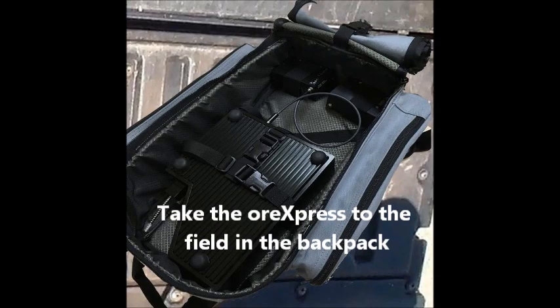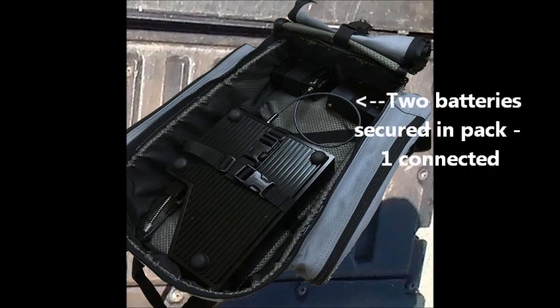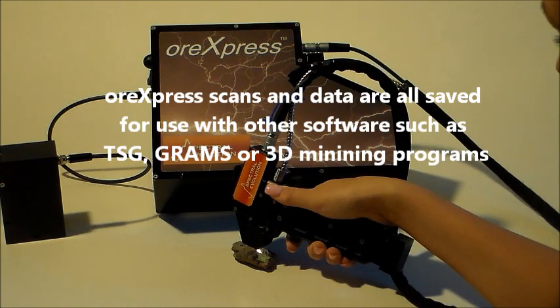The ORExpress and two lithium-ion batteries go in a backpack for field use, with the back of the ORExpress facing out and the backpack open. Each battery lasts about three hours of field scanning, with some variation depending on temperature. All files and data are saved in ASCII format for easy use with other software programs.